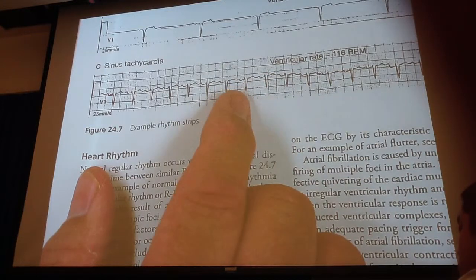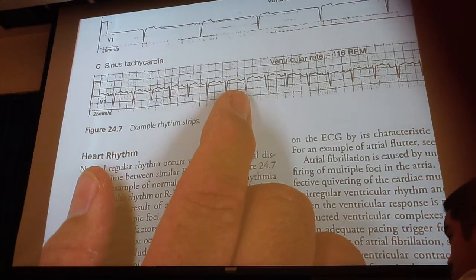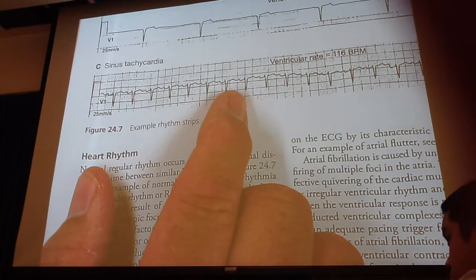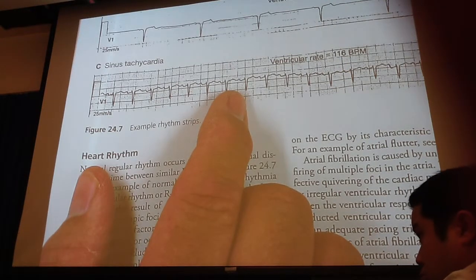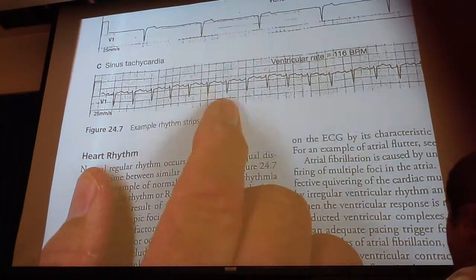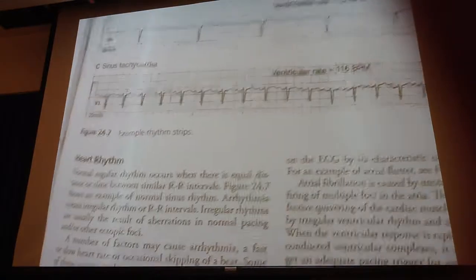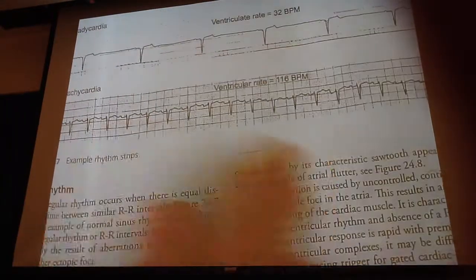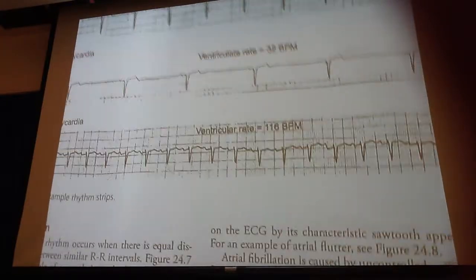Okay, you guys may be on your own. You may be at some imaging center and the doctor's going to say, okay, I'm going to be over there in an hour, so I want you to do this patient before I get there, which probably isn't a good idea. If the patient has a myocardial infarction, that's not a good idea. But the thing is, you need to know what these drugs do and when they're actually causing the effect that you want. Okay, so sinus tachycardia, we still see the PQRST, so everything is good there.